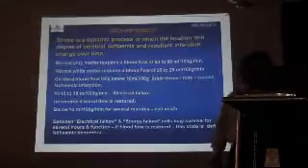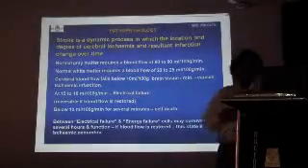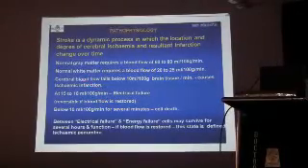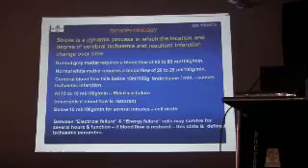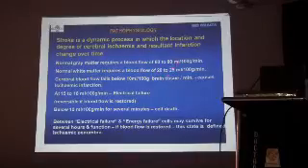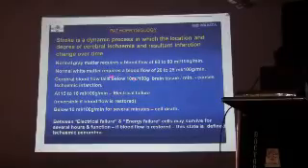Now we think of penumbra imaging. Okay. So naturally, as far as pathophysiology is concerned, normal gray matter requires a blood flow of 60 to 80 milliliters per 100 grams. Normal white matter requires almost one third of this amount of blood. When cerebral blood flow falls below 10 milliliters per 100 grams of brain tissue per minute, it causes ischemic damage.